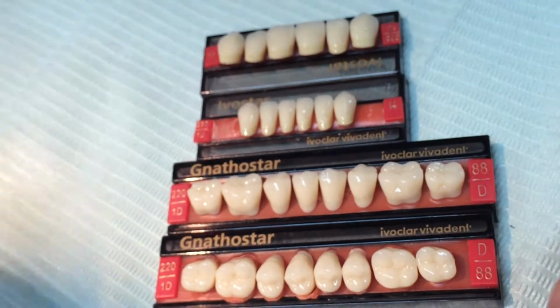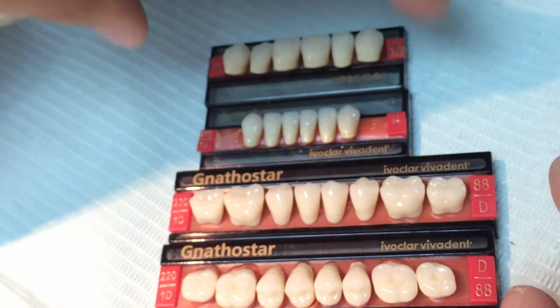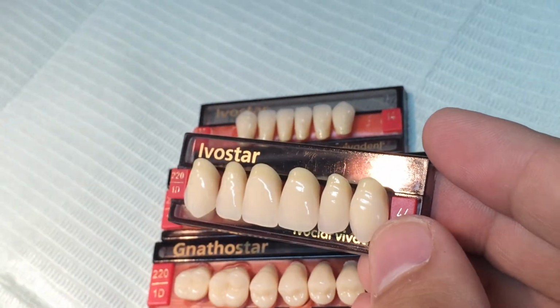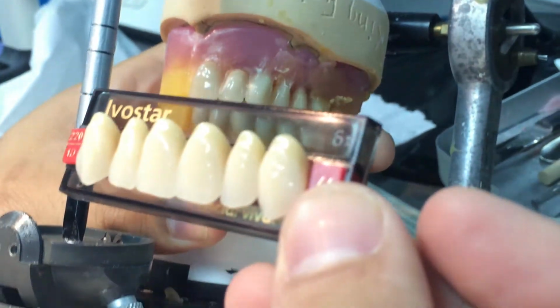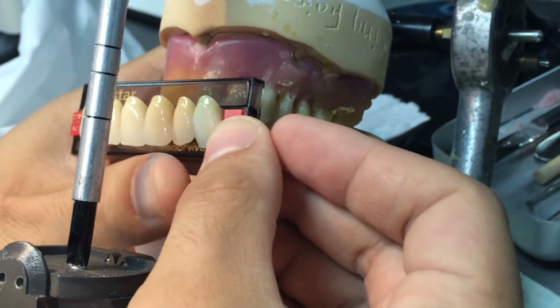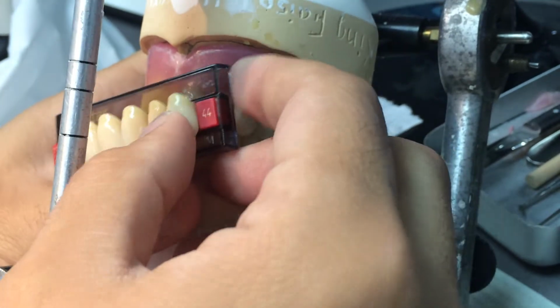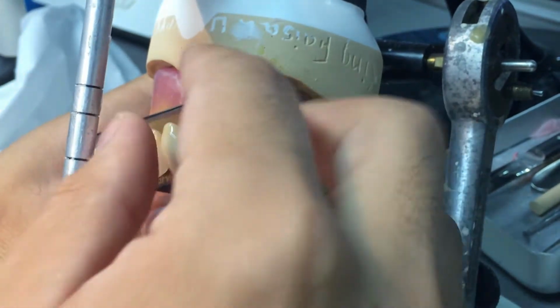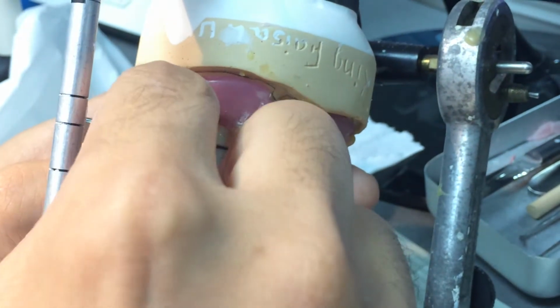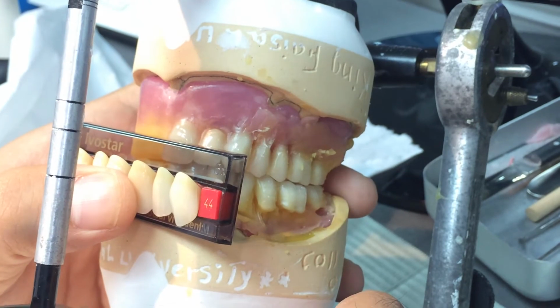Okay, how about right and left? Let's say this is the anterior teeth, and here is your articulator. You'll take the teeth set, just imagine it's going to be like this. If you take this canine, it's going to be on the same side. The lateral goes to the same side. Also the central goes on the same side.